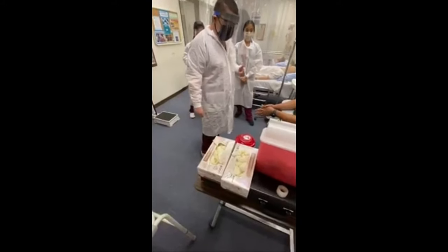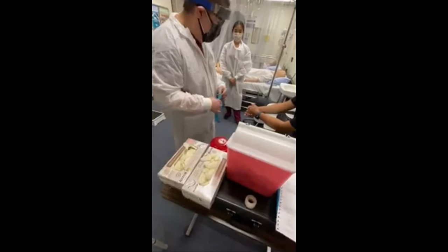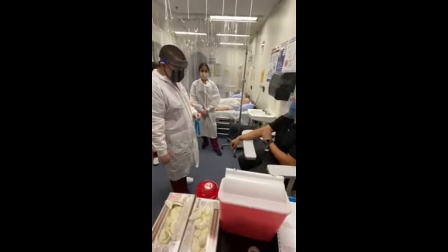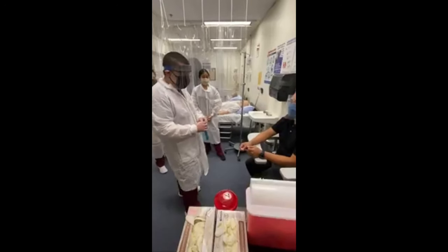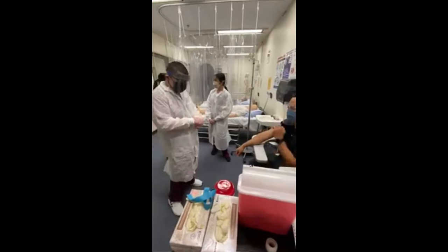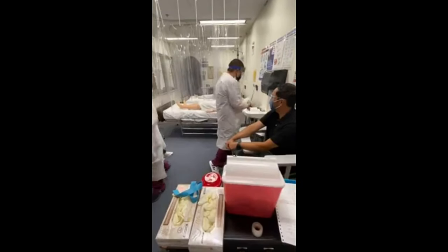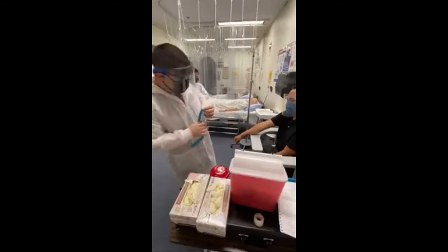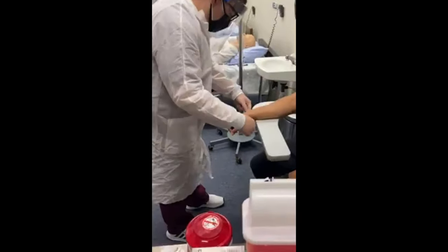and after that, the tourniquet. Can I? Sure. Oh, but before you put on the tourniquet, what are you supposed to do? Like before you touch the patient or check for the arm? Okay, perfect. So, 3-4 inches. Oh, sorry, that's the right. I thought it was good.